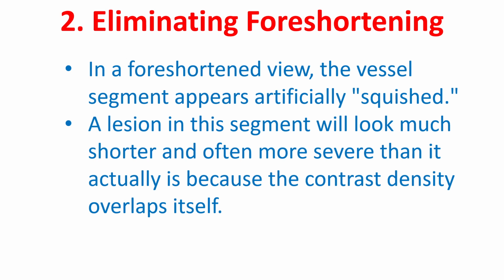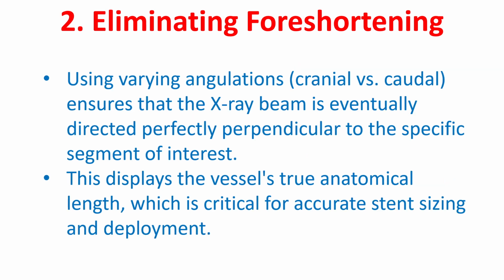density overlaps itself. Using varying angulations, cranial versus caudal, ensures that the X-ray beam is eventually directed perfectly perpendicular to the specific segment of interest. This displays the vessel's true anatomical length, which is critical for accurate stent sizing and deployment.